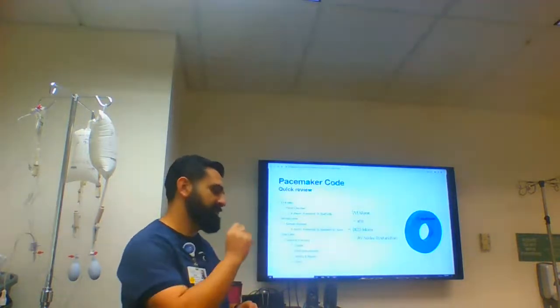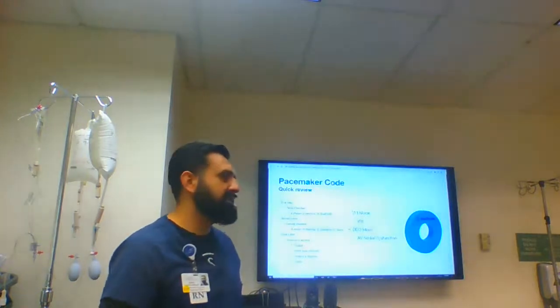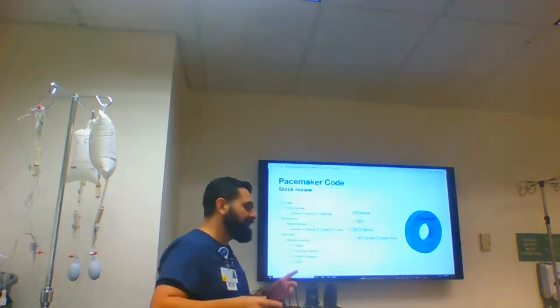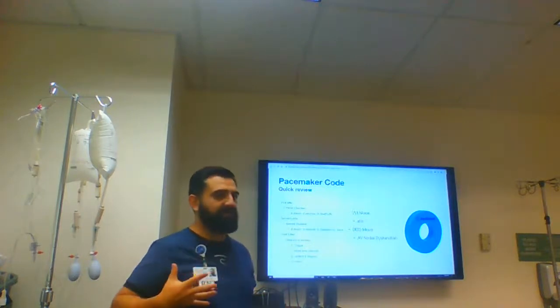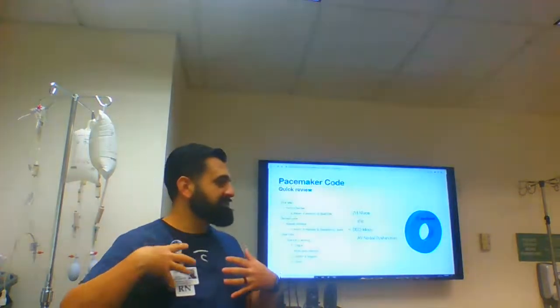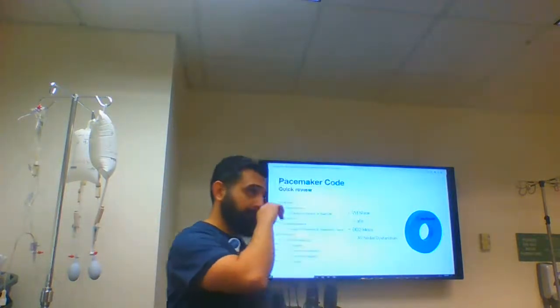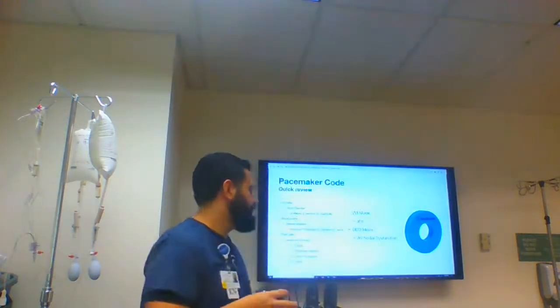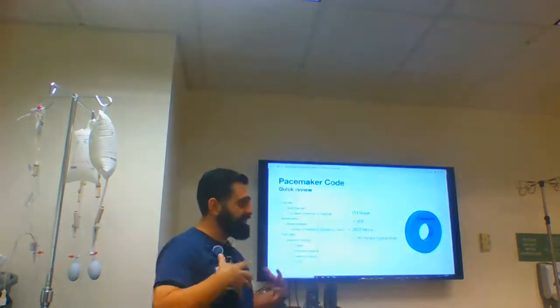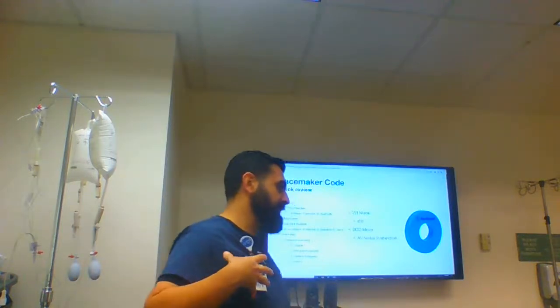But one of the settings in the pacemaker is going to be your amplitude or your milliamps. So just know that your milliamps, whenever they're transcutaneous, are going to be much higher because they have to travel through skin, bone, all that stuff. They have to travel through skin and bone to get to the heart, so much more energy is required.